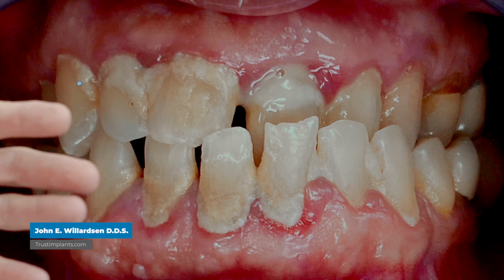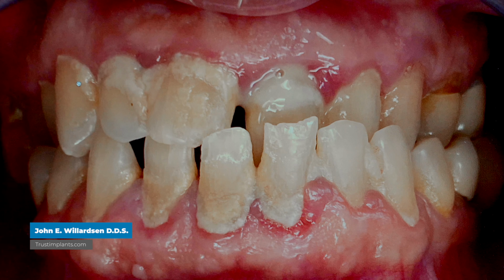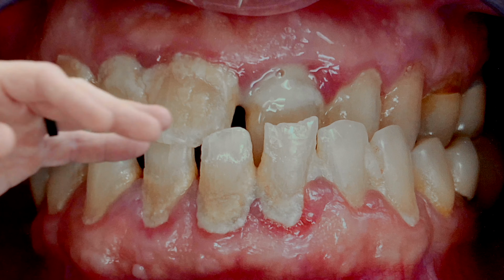I'm Dr. Willardsen, and here we're going to take a look at a case we've been working on in the last few weeks. You'll notice how the patient has an underbite. This is what we call a class 3, where the lower jaw is in front, the lower teeth are in front of the upper teeth.